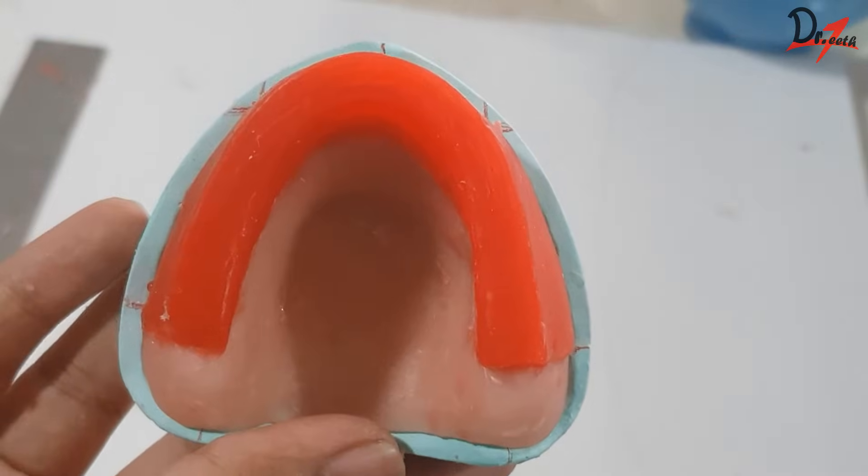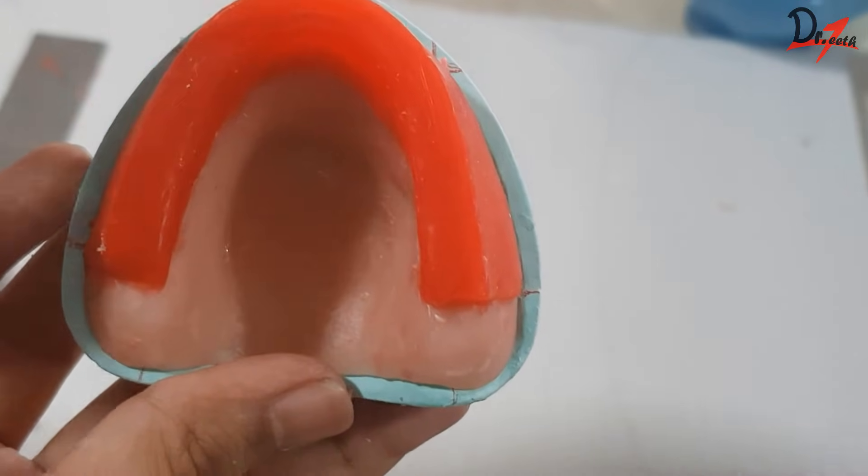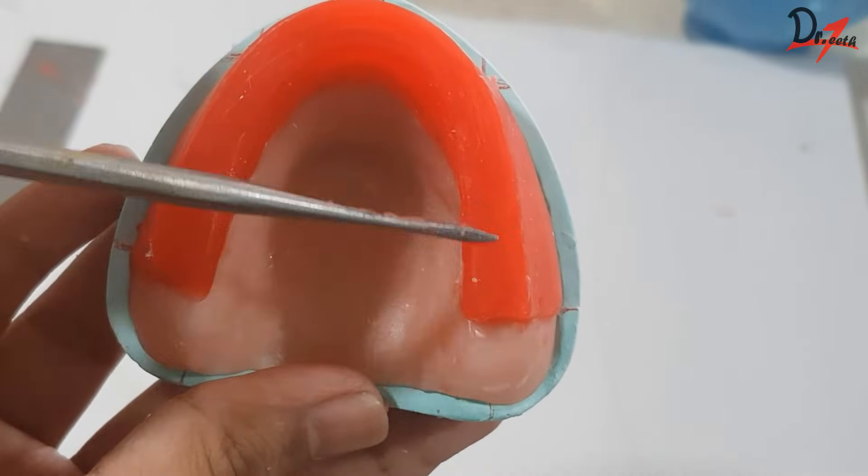Now remember that half of our rim should be on the left side of the line and half of the rim should be on the right side of the line.